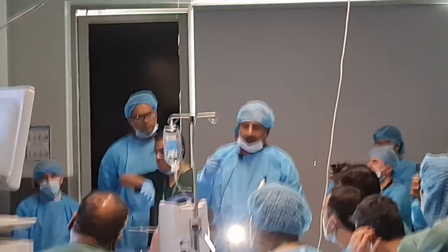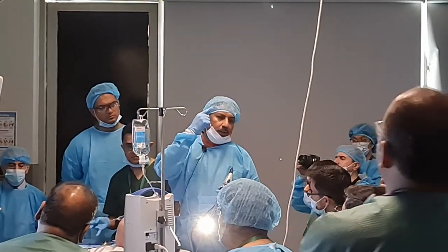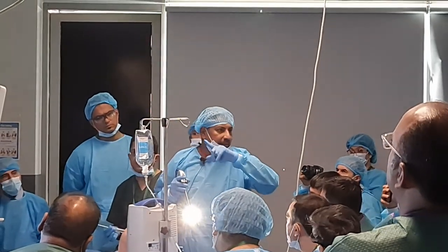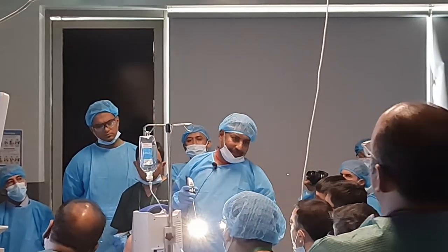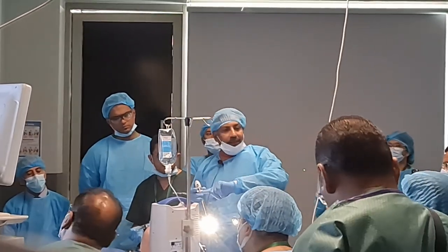Sometimes you have a pathology where, in the previous surgery, the surgeon had done some scarring in the frontal recess and some orbital prolapse also, and completely scarred that area. It is difficult to go back to the same area and there is frontal sinusitis. What can you do? Go to the virgin side, the opposite side, do a Draf 2, do an intersinus septotomy and drain to the opposite side without disturbing the scarred side.